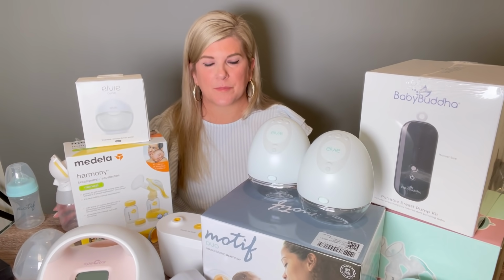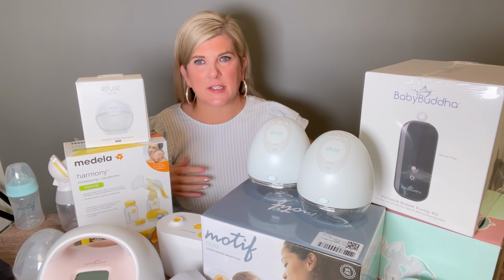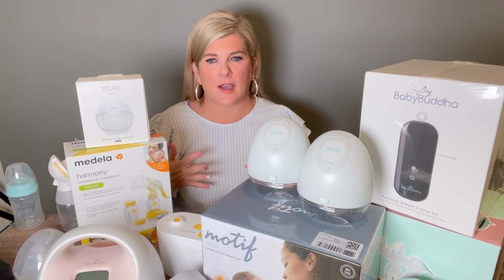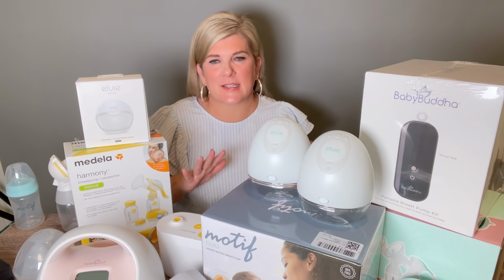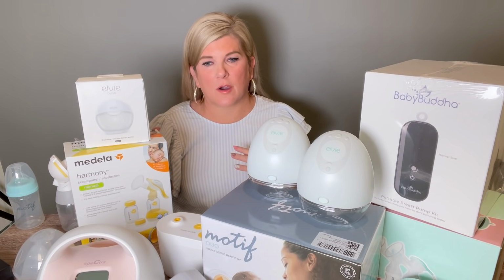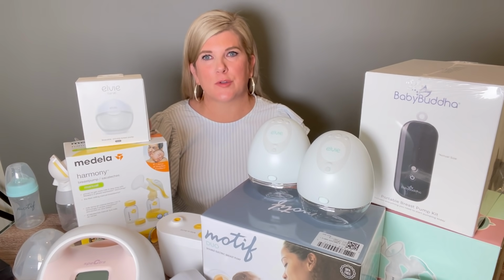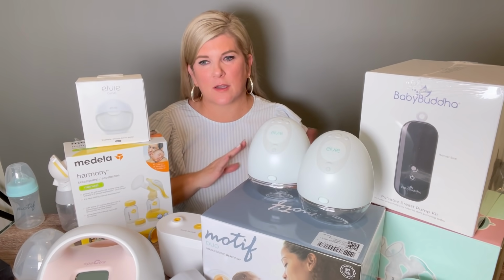So the strength and all of that kind of stuff, some of these personal use electric breast pumps now are super strong and super functioning, and they're just meant for you. So the pumps are fantastic now, in my opinion. The hospital grade pumps are great in certain situations. Again, a physician or lactation consultant would be able to guide you through that. But that's the biggest difference, that they're meant in a hospital setting for multiple users.